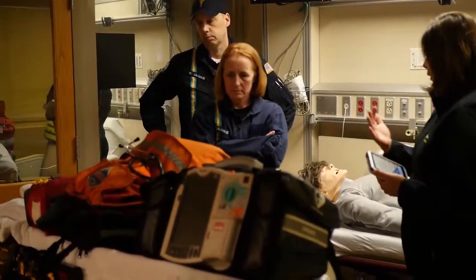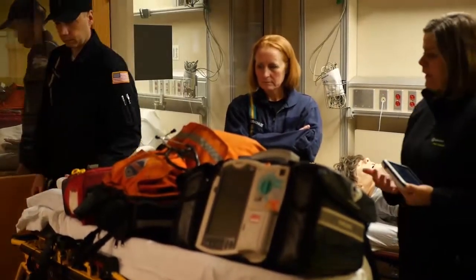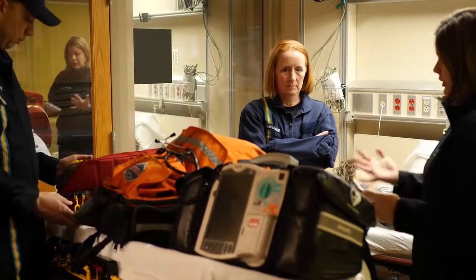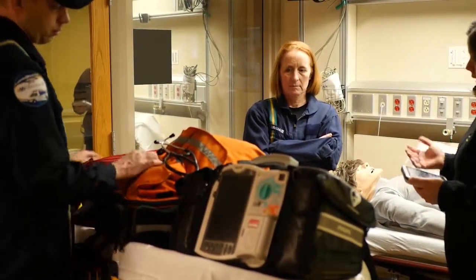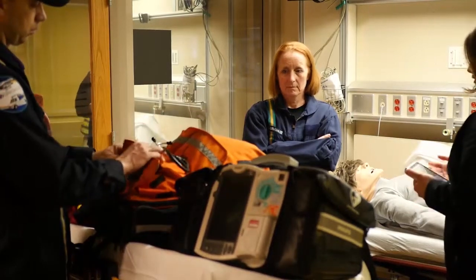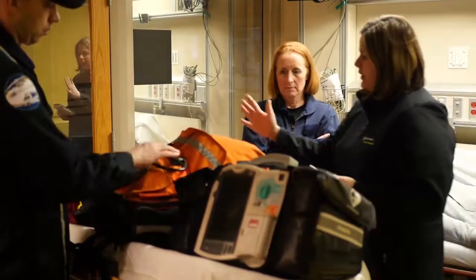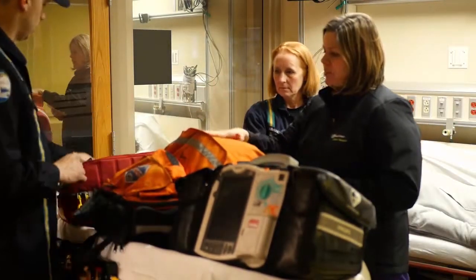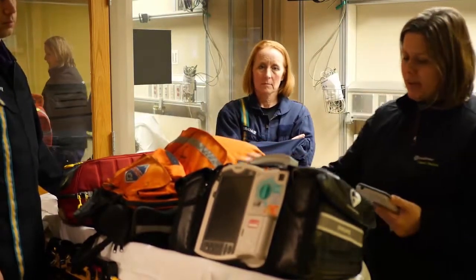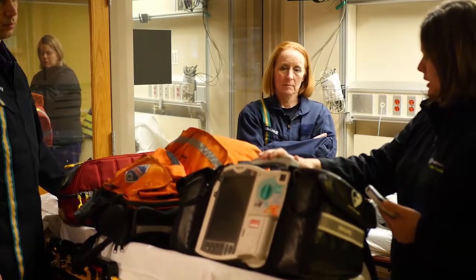And so then here is the equipment that you can actually use during this scenario. And so of course you'll bring it in as you're responding to the call. The mannequin can actually be placed on the stretcher, taking precautions of course for both your safety and for the safety of the mannequin. Here you have your oxygen tank, your bag full of all your different medical supplies, and then this is the defibrillator if you should need it or monitor that we'll be using.